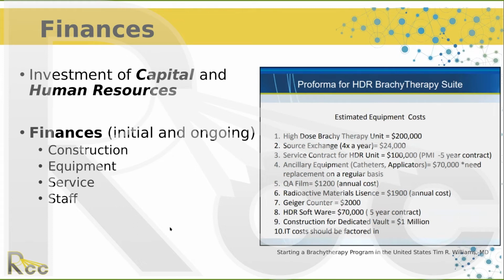That's a good question. My experience is it's always been on a flat bed couch, but I don't think so. Someone could correct me, and I could be wrong. I'm not stating this with confidence, but thinking it through, the reason we do it on a flat bed is because it's reproducible, and it's how we treat the patients in external beam. But if you're going to image them and treat them in the same way, I think it might not be such a stringent requirement. But I've always treated on a flat tabletop, so I really can't speak to it with confidence.